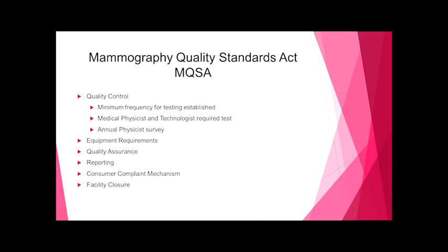I know one of these areas that I dealt a lot with was the medical audit, because the MQSA spelled out what the medical audit is. There were a lot of things that were strongly suggested, but they stopped short of making it a requirement.